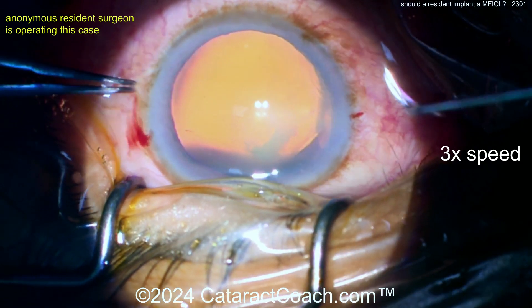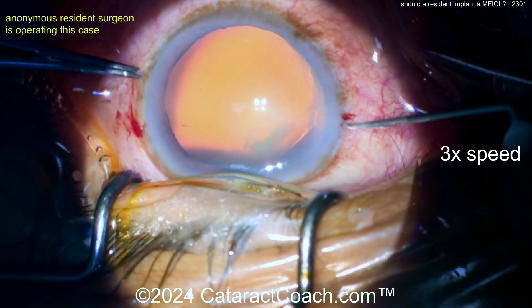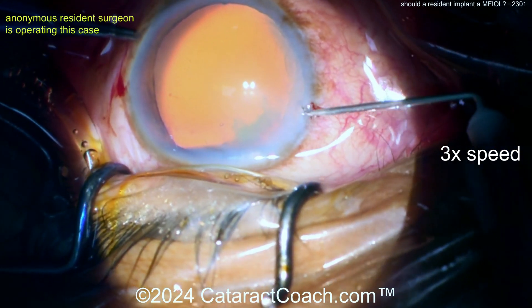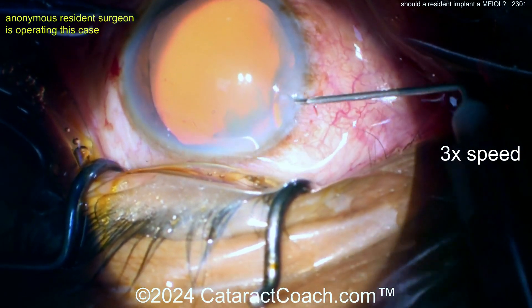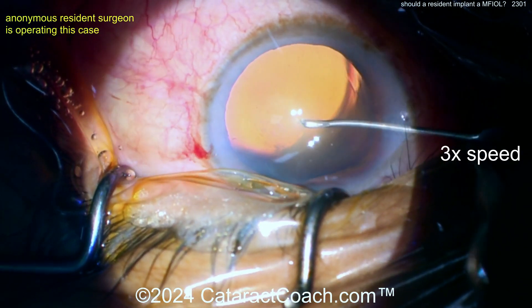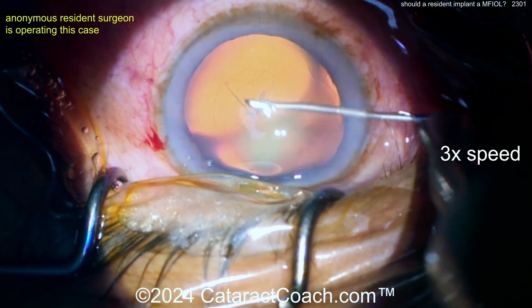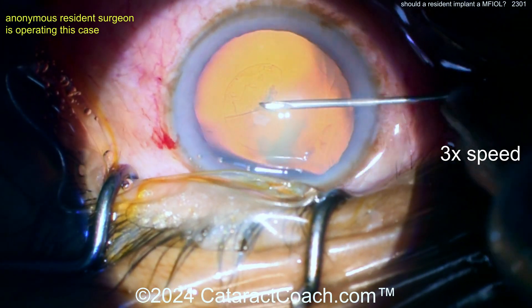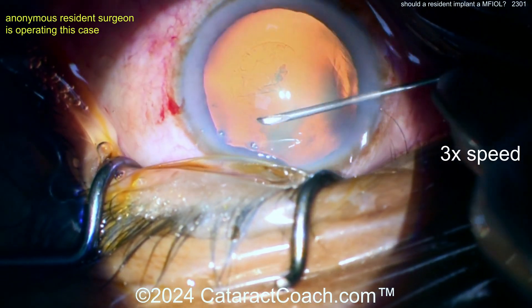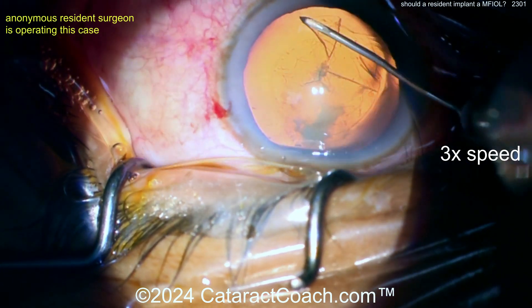A multifocal lens is a different creature compared to a monofocal lens. It is really intolerant of residual refractive error or residual astigmatism. A multifocal lens performs best when the patient has achieved basically a plano outcome with minimal or no astigmatism. Here comes the rhexis — very nicely done, all with a syringe through the side port.